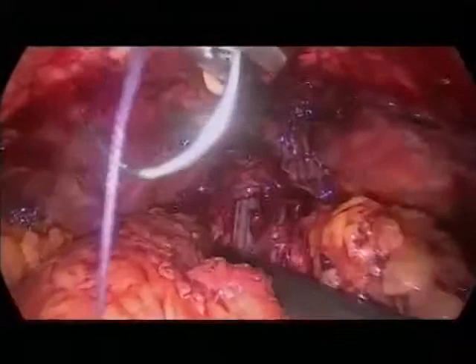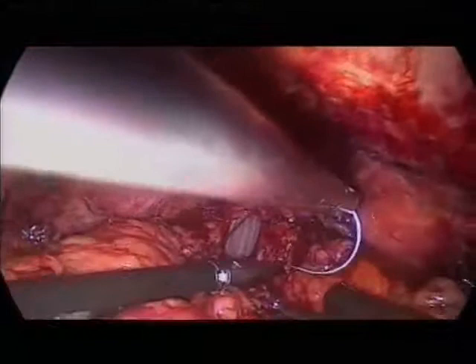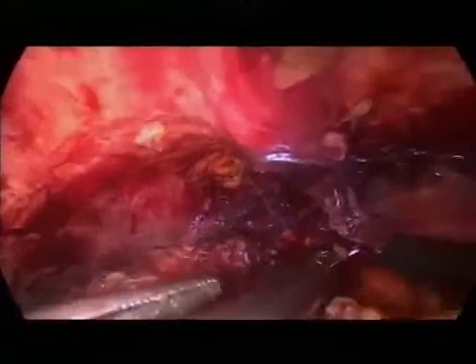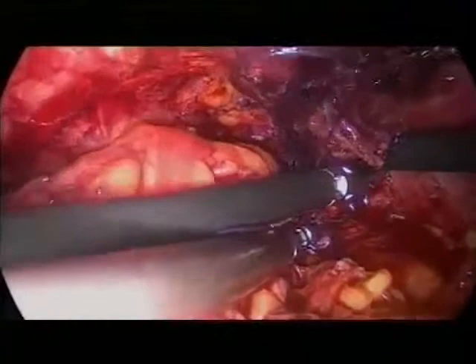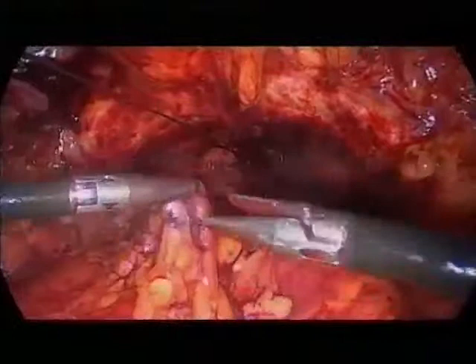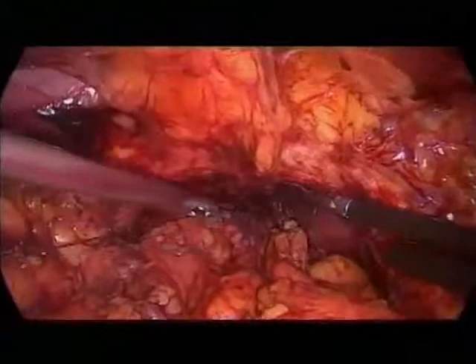So what we do now, 2 stitches laterally. That means 1 stitch here at the 3 o'clock position, mucosa, and this is the easy stitch. Because you go in at the bladder neck and out at the urethra. Let's say a one-way stitch. And this is a stitch, you know, we have these modular surgical training to teach, where the guest or resident starts with easy parts of the procedure. And when they start the suture, they start with this kind of suturing, because this is easier than the posterior part. Come in.